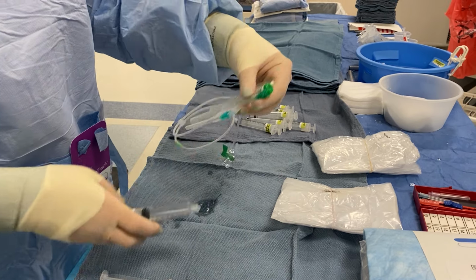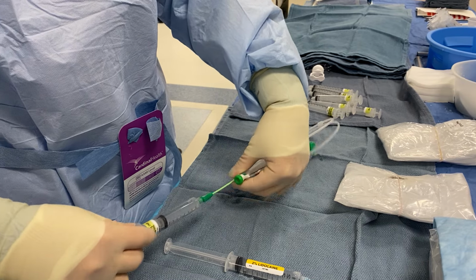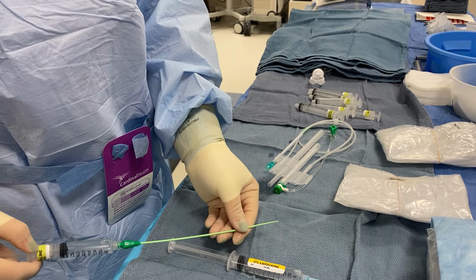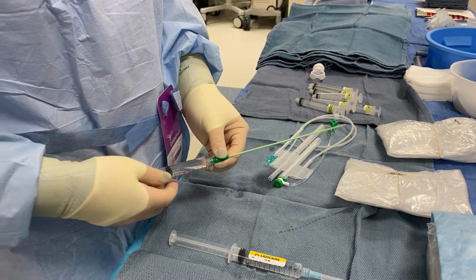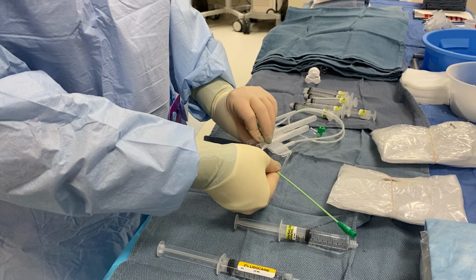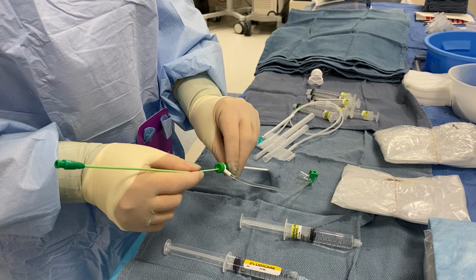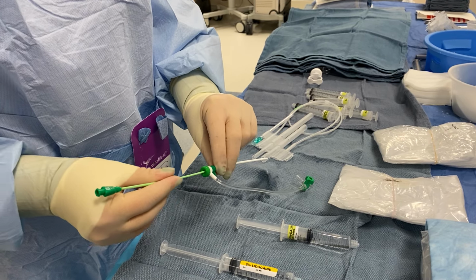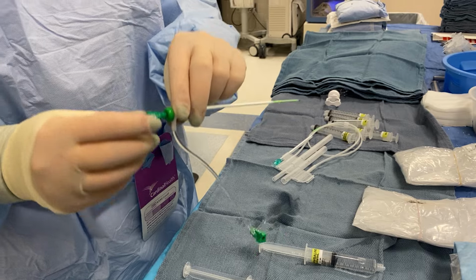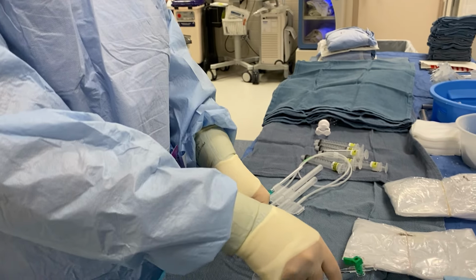Then I wanna flush the dilator. So our dilator is right here. Just gonna stick the syringe on and flush. Only takes about half cc or so. And then I'm gonna take our dilator and stick it right through the valve on the sheath. And I'm gonna advance it all the way until you hear a click. And now that's ready to go.